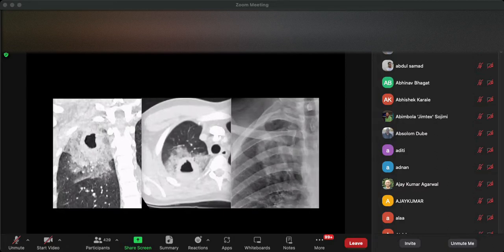And this patient is coughing up purulent phlegm, and this turned out to be just a lung abscess. Okay, but could it be a patient who's got a cancer? Well, yes, of course it can. All right, but this patient just turned out to have an abscess. So the point about this one is an abscess can look very much like a squamous cancer and vice versa. Could it be TB? Yes, it could, but less likely, I think, given the scale of the cavitation.